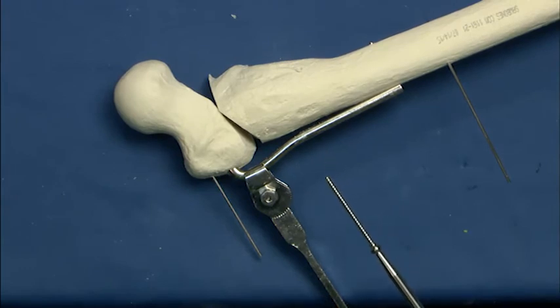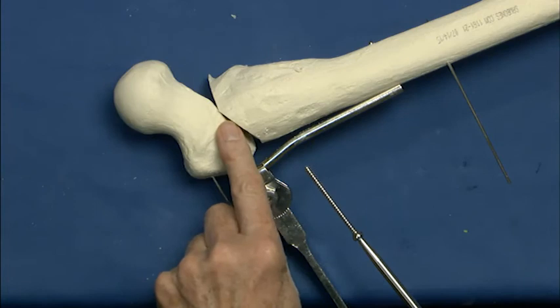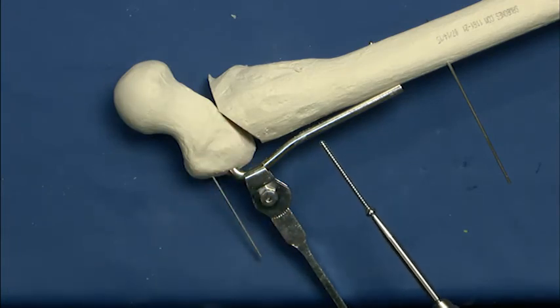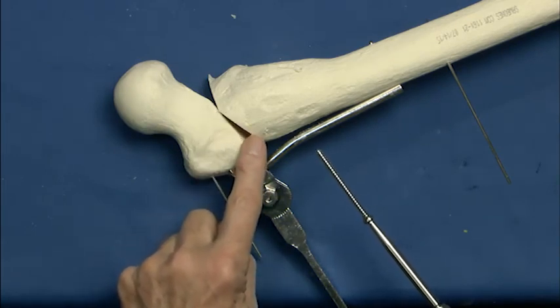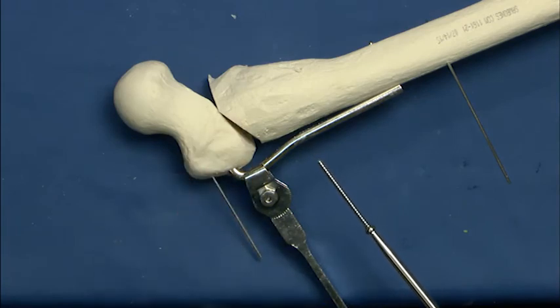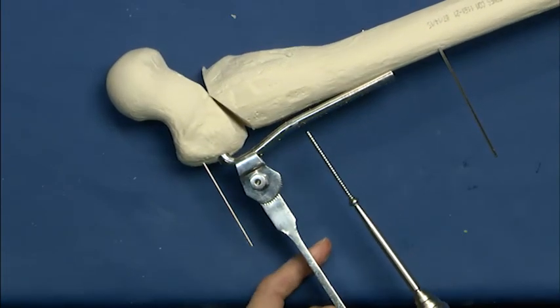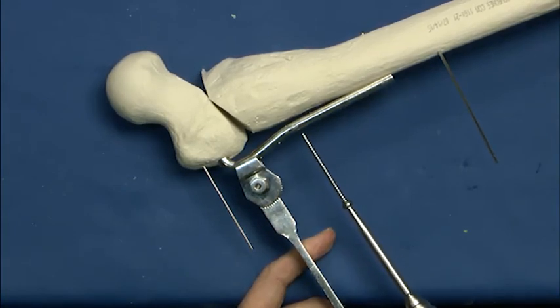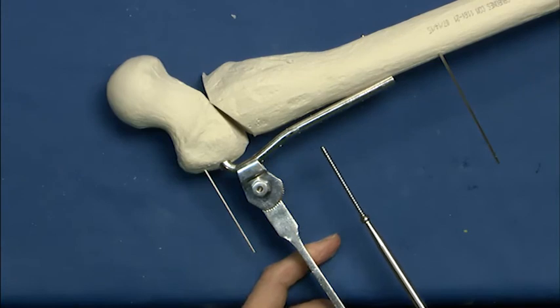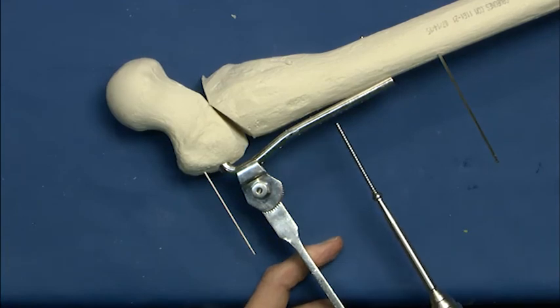It is possible to have done this without an anterior closing wedge. If you wanted to essentially have a single point of contact anteriorly, you could have had an opening posterior wedge and still generated mismatched compression. So you really only need one plane of compression along here, although obviously the bigger the contact area at the point of compression, the better off you're going to be. So normally you can do this as one screw. The farther off you are, the more likely it is to be safer to use two screws, like the sequence for tightening the lug nuts on a wheel, going back and forth between two different screws.